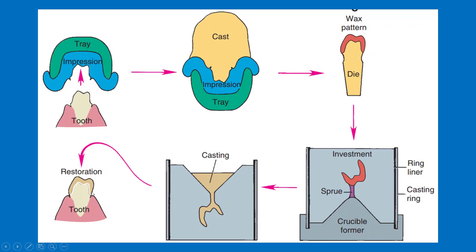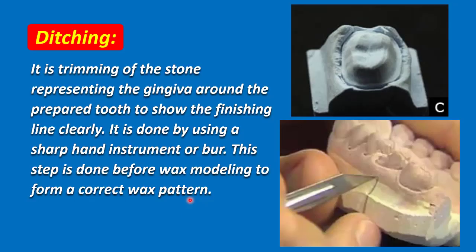This is a case of a full metal crown. Now, before forming the wax pattern, it is important to do ditching. Ditching is the trimming of the stone representing the gingiva around the prepared tooth to show the finishing line clearly. It is done by using a sharp hand instrument or burr.